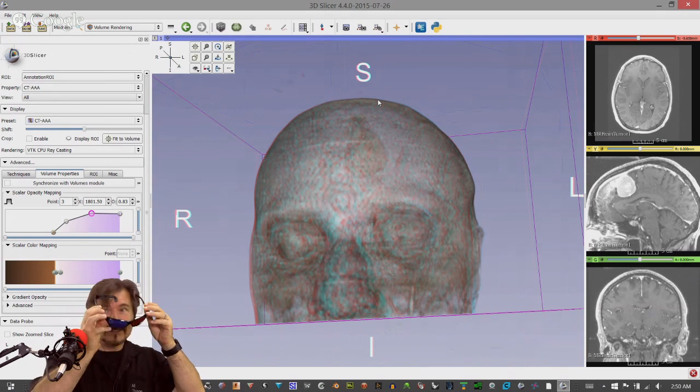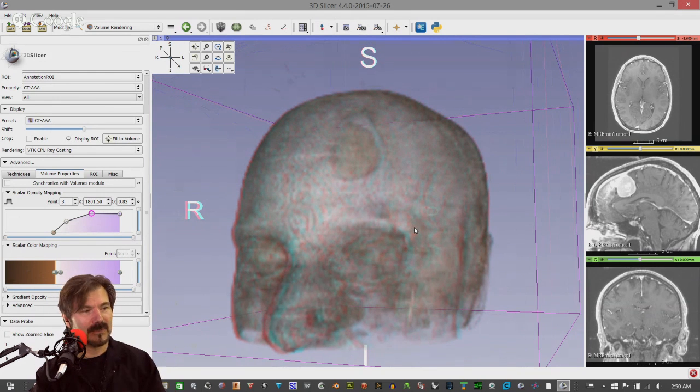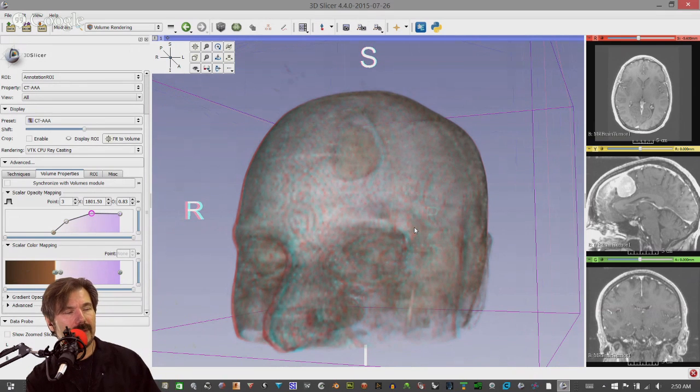Yeah. How does it look? You want to take a look at it? Oh, just kidding. Yeah, it actually looks pretty good. So if you have some glasses and you don't have to spend much for them, you can get a three-dimensional view. They make some polarized ones, and I have one that uses either vertical or horizontal, and you then use polarized glasses like you have in the movie.